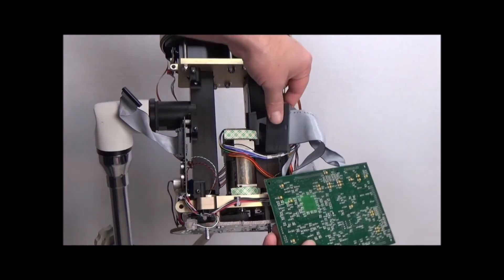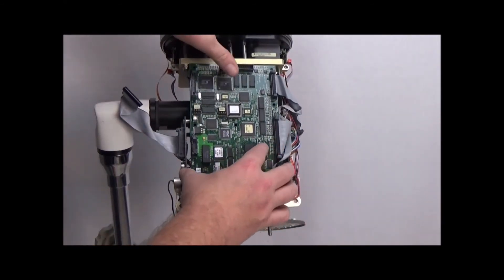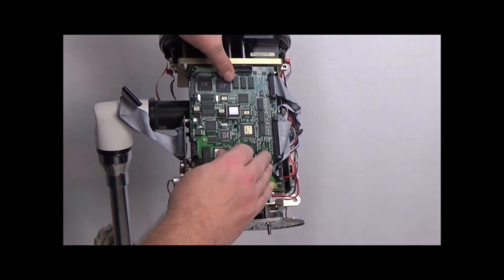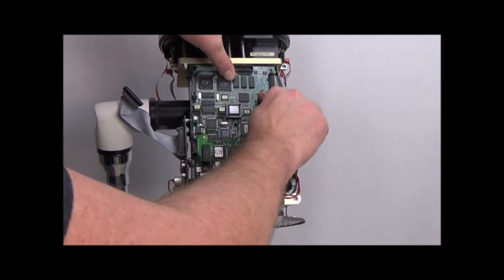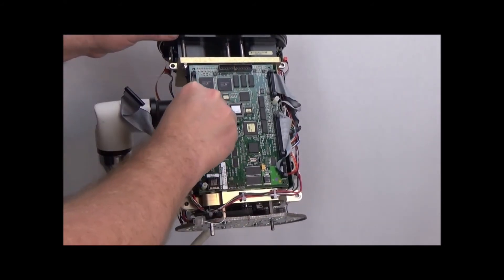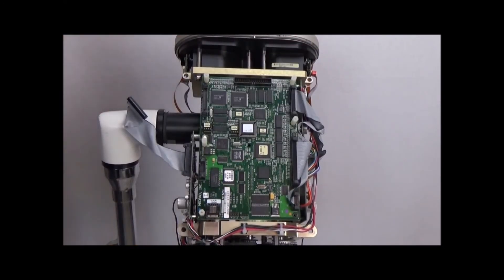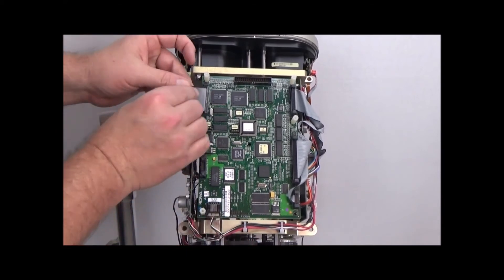Put the head CPU board back on — make sure it slides into the gap up here. Then put your standoffs in. If this one stays empty, that's where your display board plugs in and gets screwed onto. Plug this cable back in, then plug this cable back in.